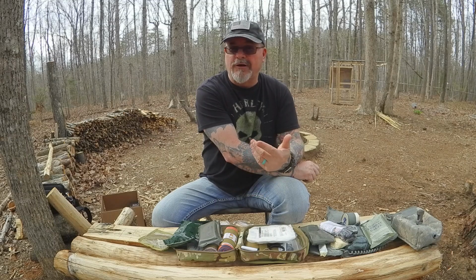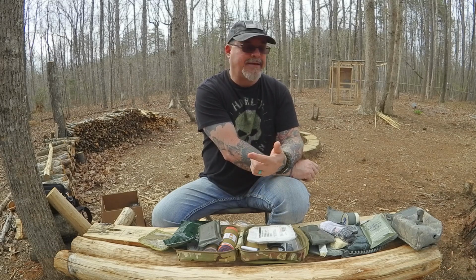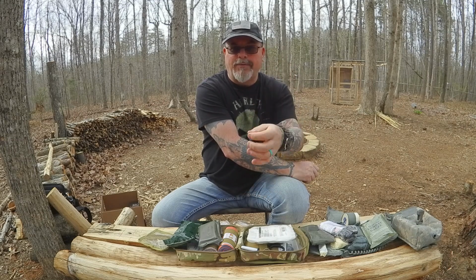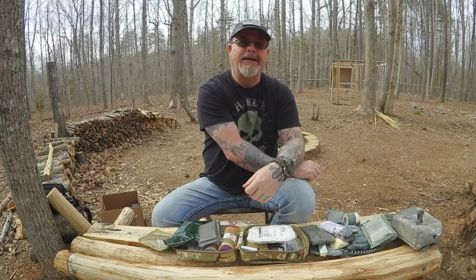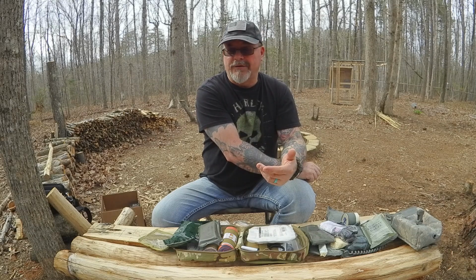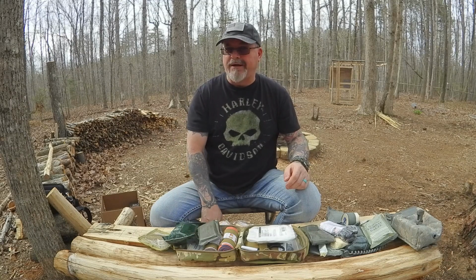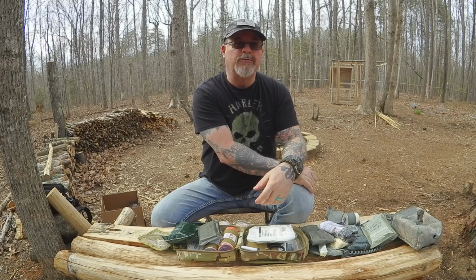But you have to understand what the concept for an individual first aid kit is in the first place, which is to give yourself individual first aid. Okay, and it's to give individual first aid on serious injuries. If you get a paper cut, you're not going to need an IFAK for that. You're probably going to wipe the blood off and hold your finger there for a couple seconds and then go about your day. You might put a little band-aid on it. But if you're using an axe or something out in the woods and you end up cutting yourself severely, then having a pressure bandage like this where you can clean it up, bandage it up, tie it off, get yourself some help, that's what you want.